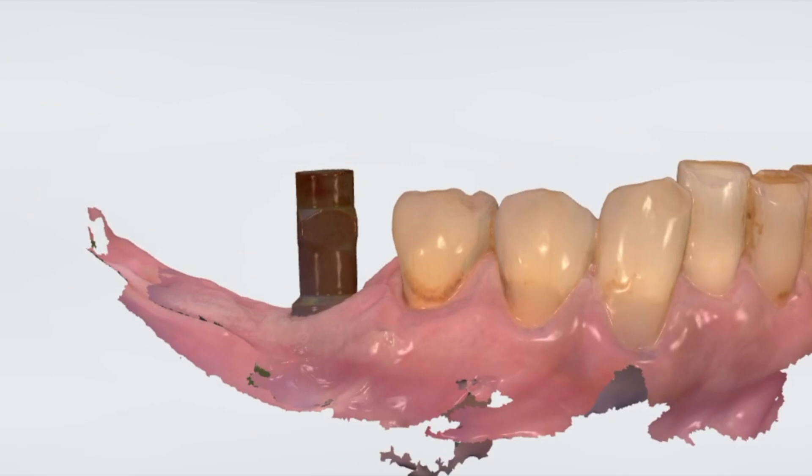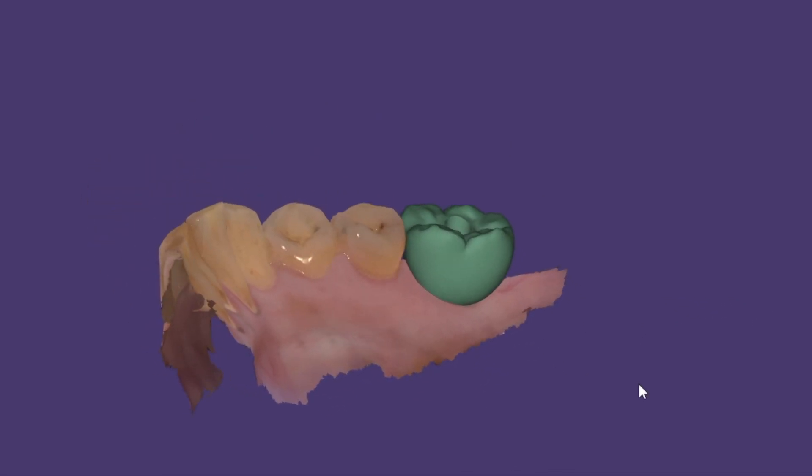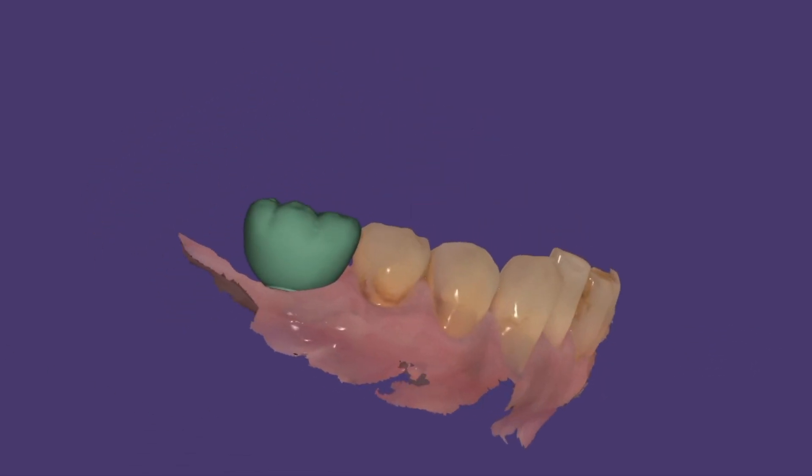Here's the scan, and here's the designed crown in the ExoCAD software. We get that back and then plug it into the Roland mill.